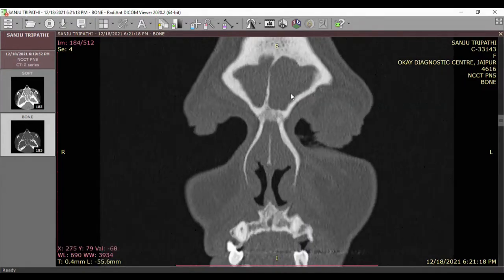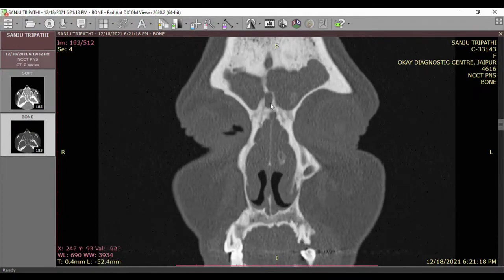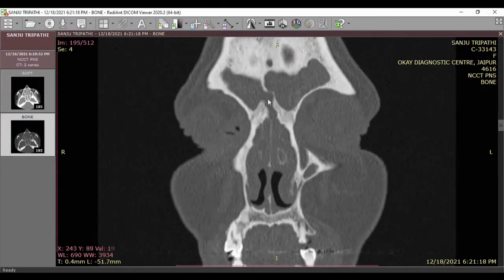Again, I am showing the example. Anteriorly, no cell, no cell, no cell. This is an intersinus septal cell, the most anterior one. See, pneumatizing the septum. Can you see clearly? And this is opening to the right side. Clear? Yes, sir.